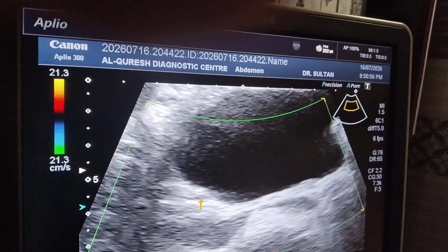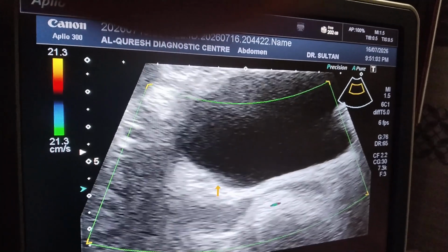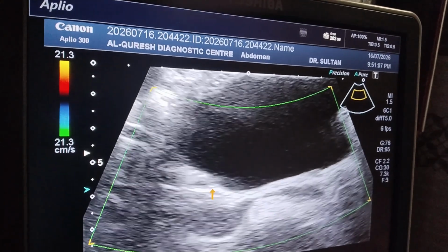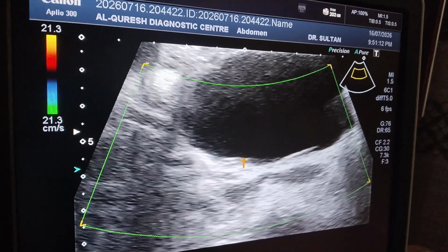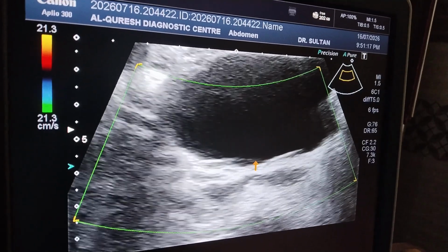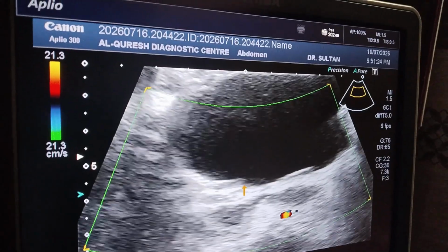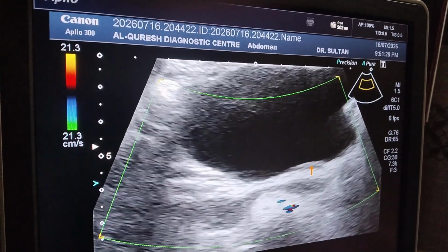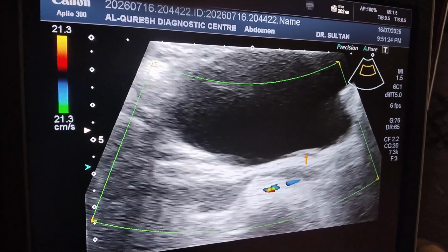Due to this oblique turn, the flap valve mechanism acts, and the reflux, which should not be present in a normal patient, is prevented here. Look here, this is the urinary jet. In between the urinary jets is the trigone area and the base of the urinary bladder. Thank you very much.